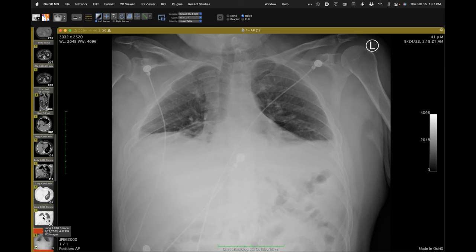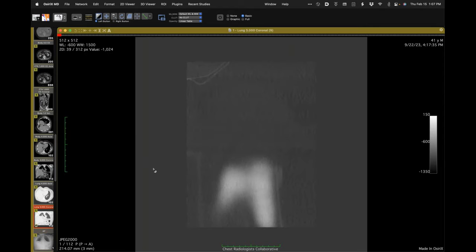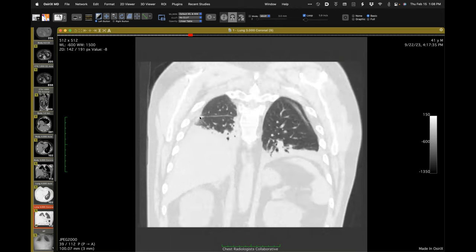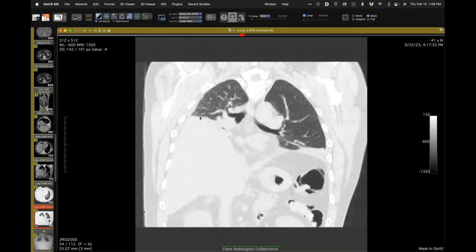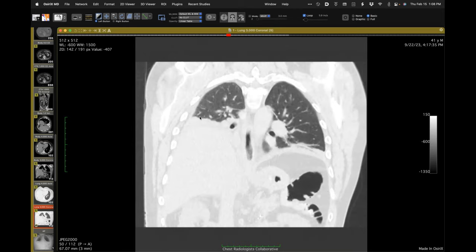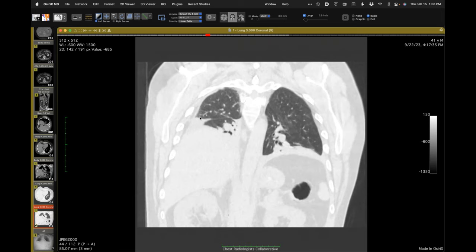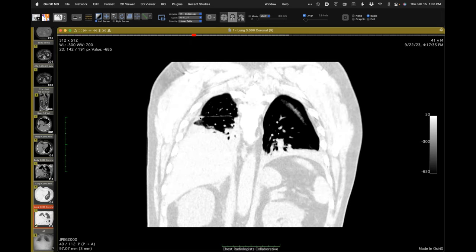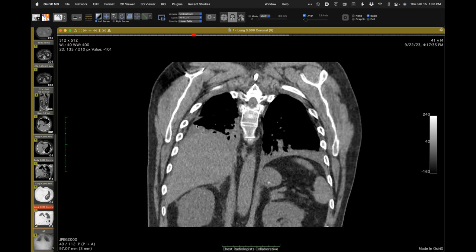They also took a CT just after, and it shows the same findings: small static lung volumes and basal lung opacities consistent with atelectatic lung.